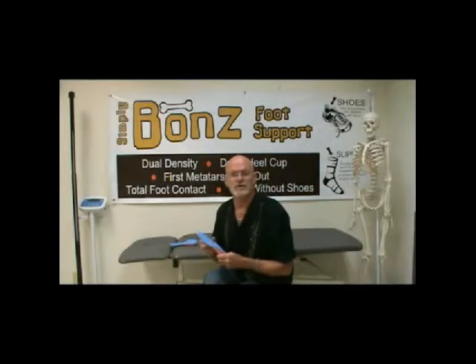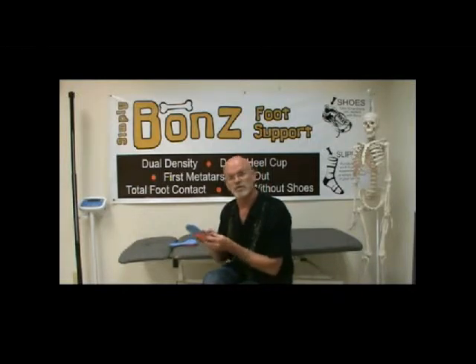of two different densities of foam. Okay, this top cover, this foam is called ethyl vinyl acetate. It's what you see in the midsoles of running shoes, and it comes in different densities. So the top cover here is a little bit softer, and then the shell underneath is a little bit firmer. So you get cushioning and control out of these guys because of the dual density nature.